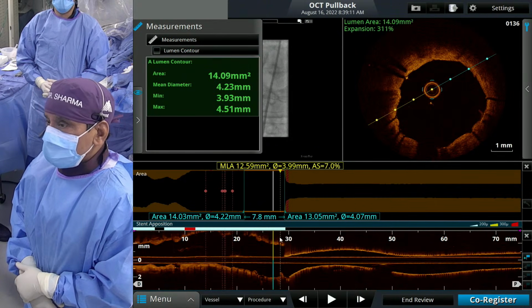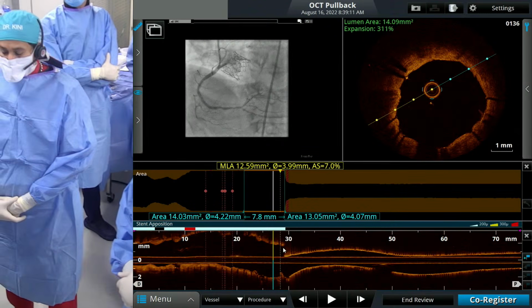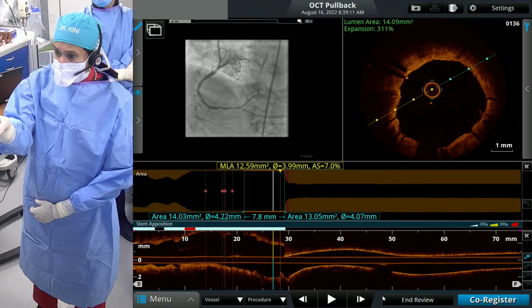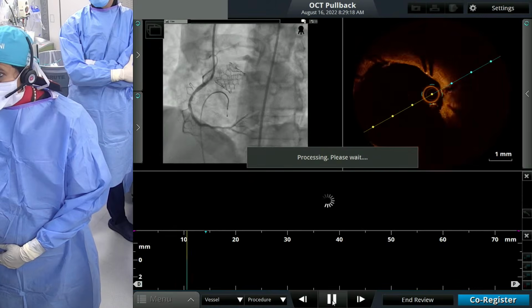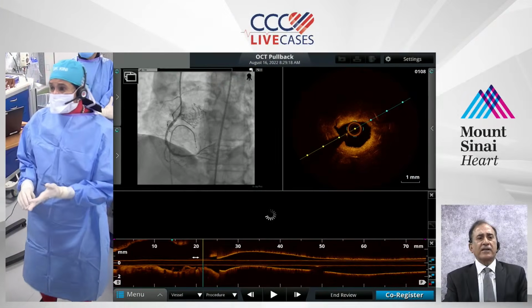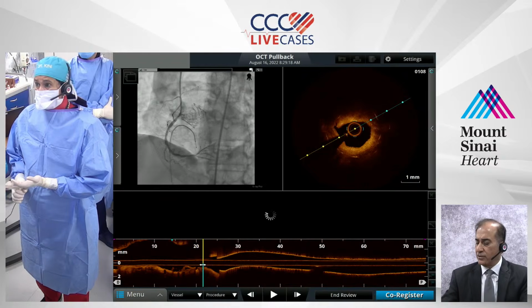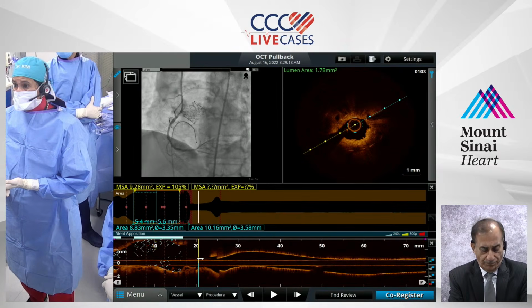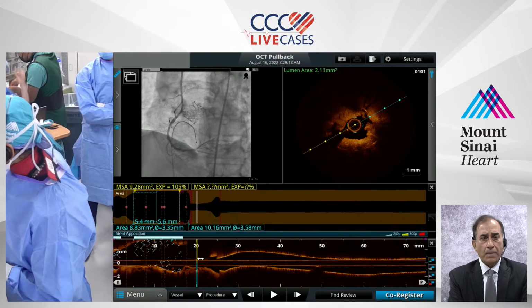Yeah, in our calcific app, if you go and check the basics, we have described how laser atherectomy works with nice slides, exactly the mechanism. And let's go back to the second picture after we did the laser. So what we see here, disruption. We also see this kind of disruption when we do rotational atherectomy. Absolutely, exactly. And that is supposed to be fundamentally the mechanism. Sameen, in the meantime, I have verified the coronary lasers are 0.9 and 1.4, and the peripheral are 1.7 and 2.0. Okay. And this kind of thing, we could also see when we do cutting balloon, which we have seen.